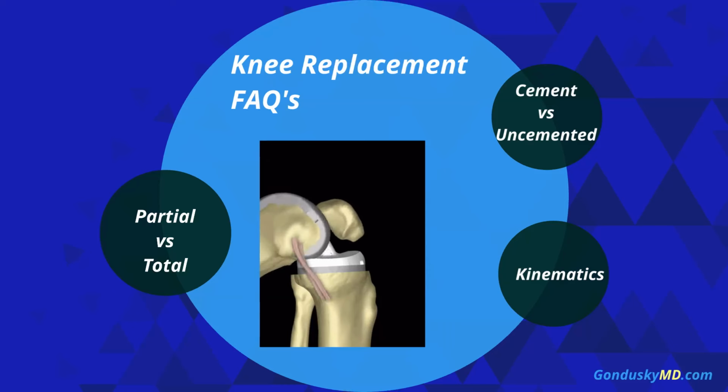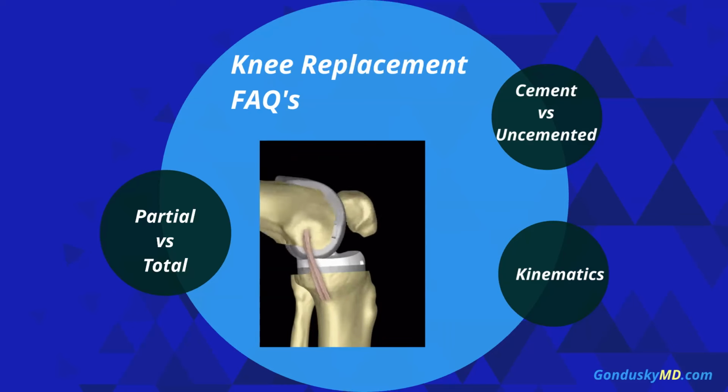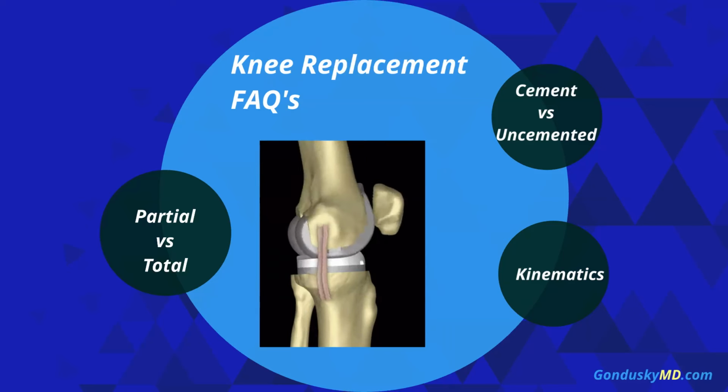Patients ask if the replacement weighs more. Generally, the weight of the components is pretty similar to what we take out, so not a big change in weight with the components.